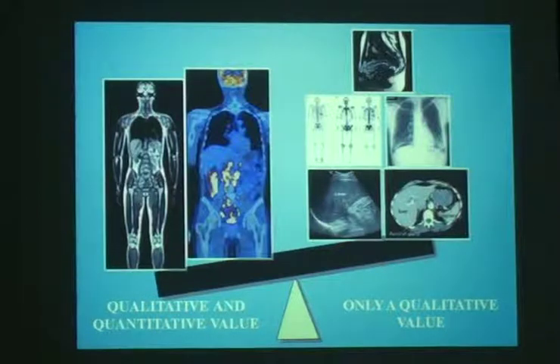because a conventional radiological study, an ultrasonography, and a CT study are only qualitative, descriptive tools. But when comparing MRI to PET, we are including both qualitative and quantitative methods. It's a functional tool as well as an anatomical and descriptive pathological tool.